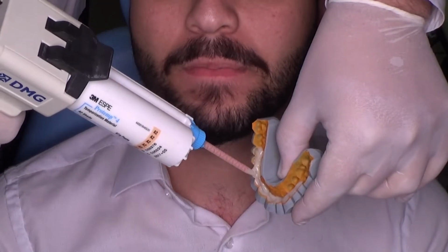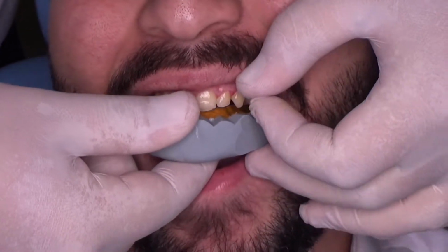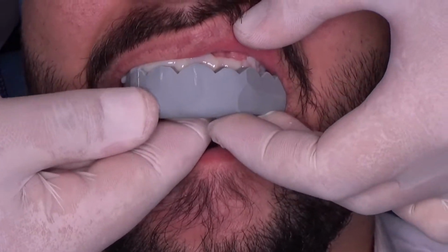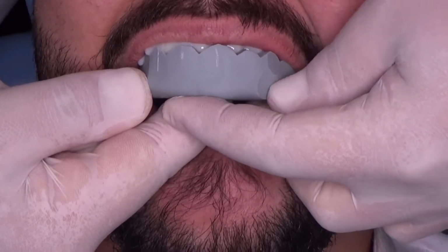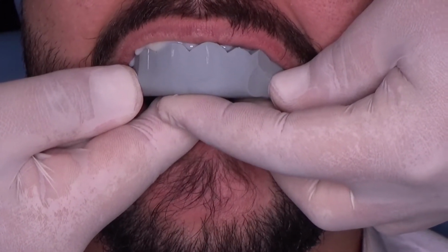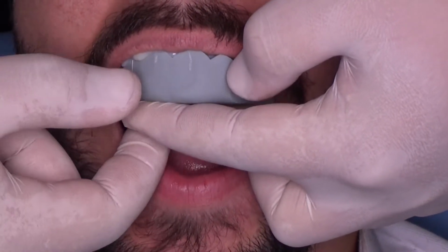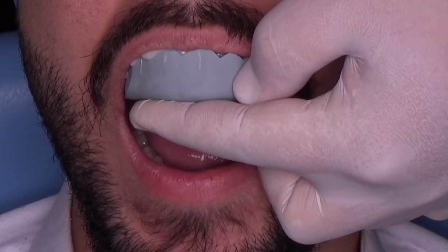So it is a photopolymerization composite, no? No, it is bisacrylic composite, which is not photopolymerization. Okay. It is a self-curing composite. Okay, great. You press from the palatal to the vestibular to be sure that the axis is out of his mouth, you see? So you keep the key in perfect position. We wait approximately a minute and a half, and the bisacrylic will start getting elastic. In this stage, we will remove the excess with an explorer.